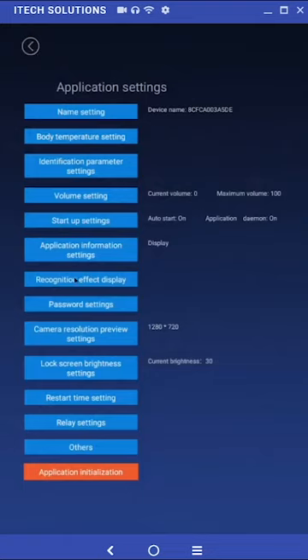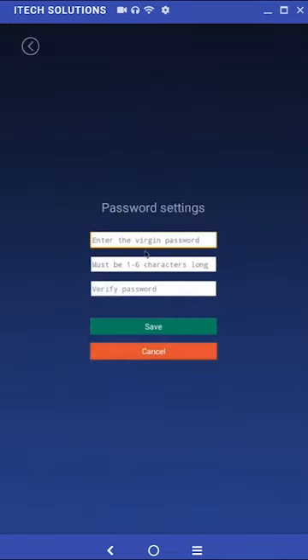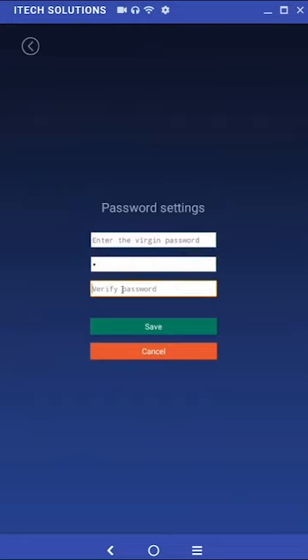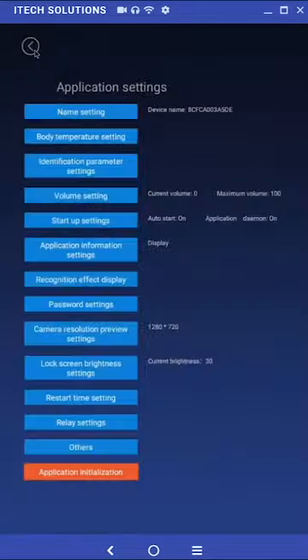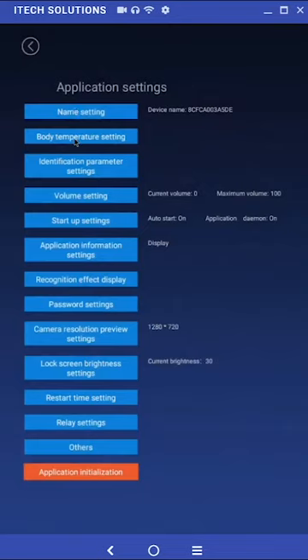Password setting. This is where you will be able to change the password. For the purposes of this video we will enter one as the new password in the fields. Choose your own password. Once entered click save. This will take you back to the previous menu.